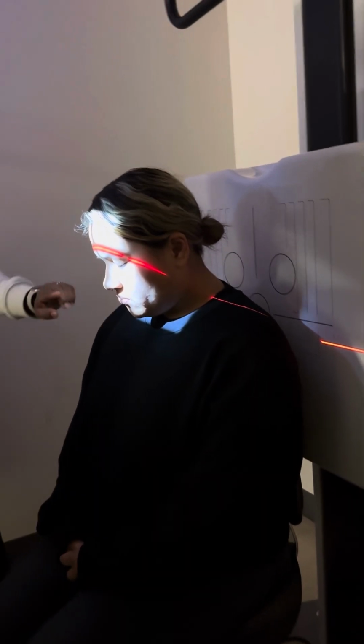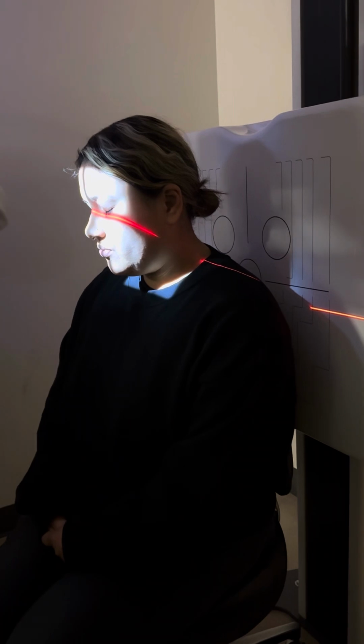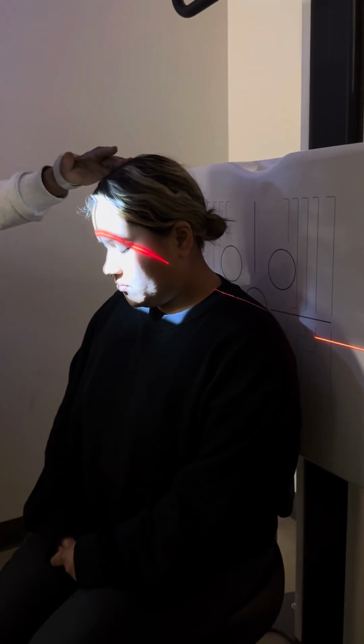Cool? Go ahead. Do we need to drop it a little bit there? Just right between your eyebrows, the best you can. Okay, so it was a little bit off then. What I would look for is whether or not it's coming across the zygomatic arches. Chin up? Yeah. Okay. We're just seeing it today. When you do it, we'll go over it.